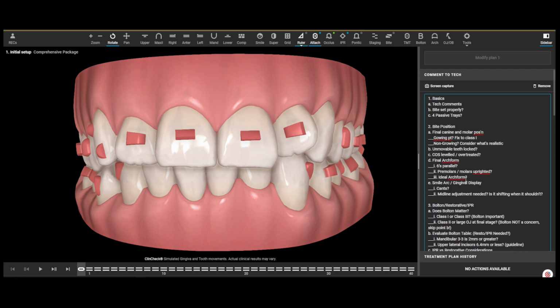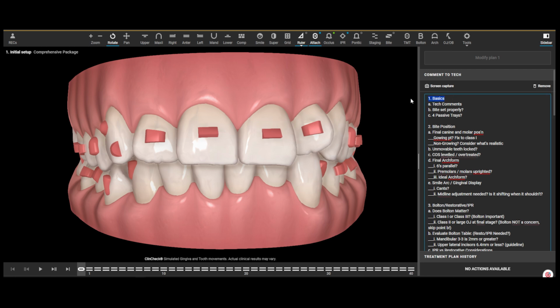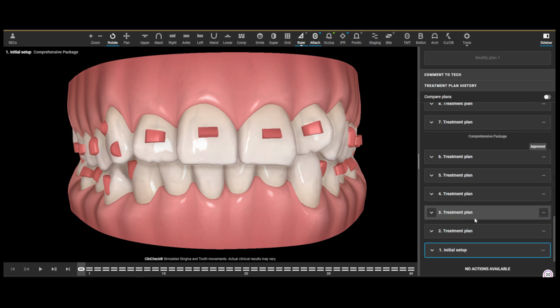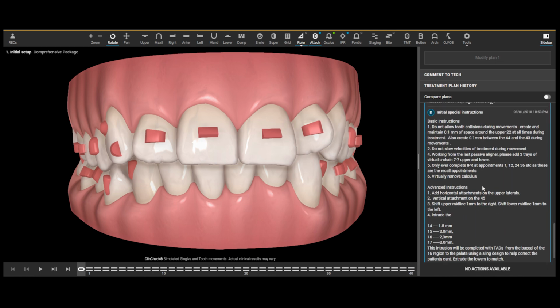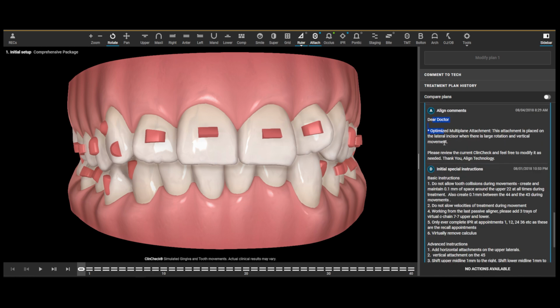And it's going to pop in then essentially a checklist of things that I want to review to see if they were done properly. So the first thing is kind of the basics. What did the technicians come back with in their comments? So they've told me here that optimized multi-plane attachments were used, and please review the current ClinCheck. That's it.